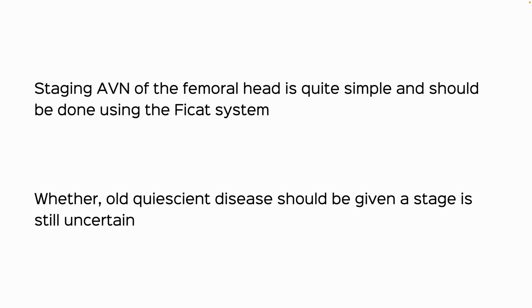Perhaps in the future, another day, I will look at differentials of AVN and how to diagnose it and differentiate it from other similar entities. But today, the whole issue was just about staging AVN.